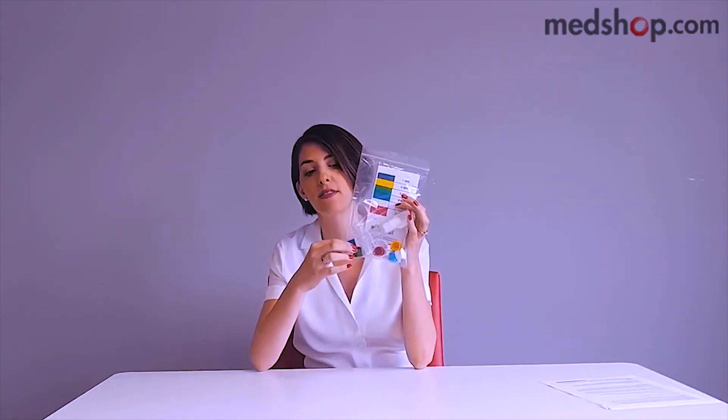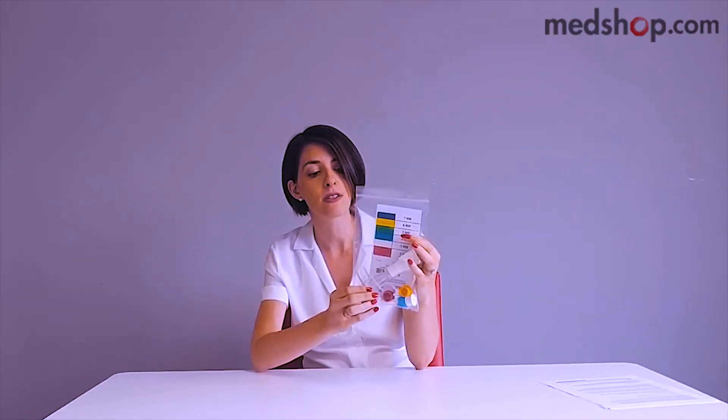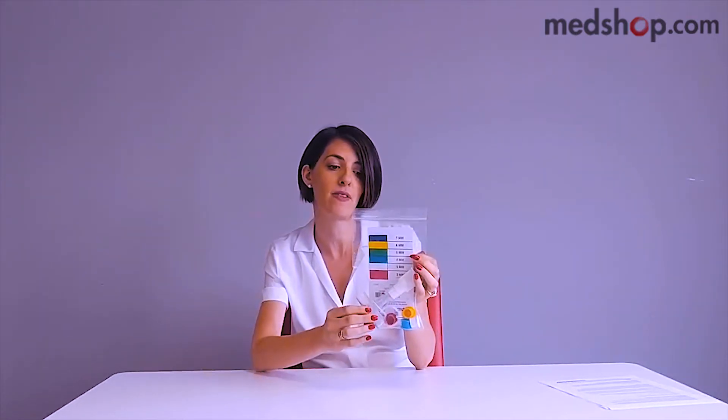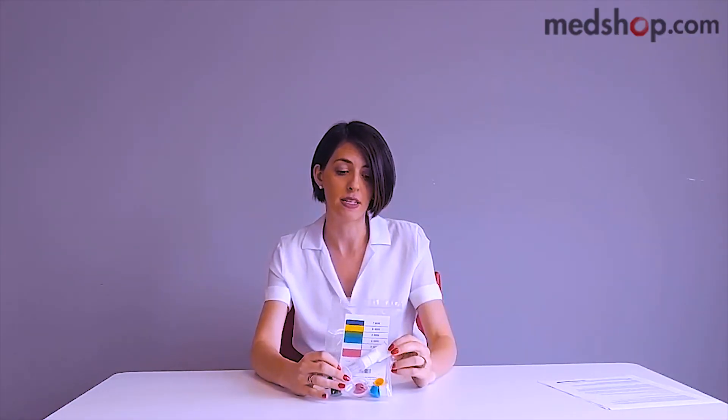The way this particular trainer works is through resistors. This package has six different color-coded resistors with different diameters for different difficulty levels. So as you increase your lung capacity and your strength, you can go up in levels and increase your capacity even more.